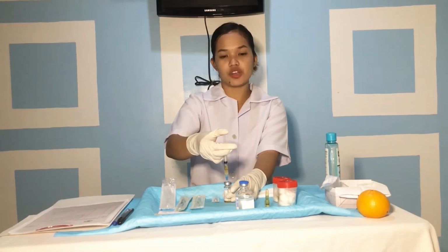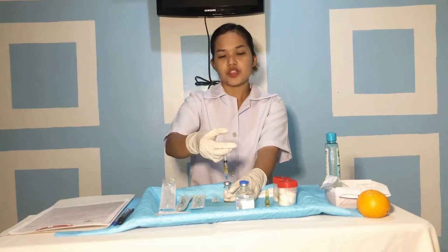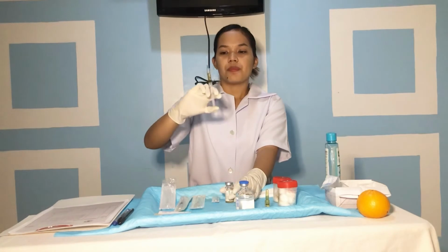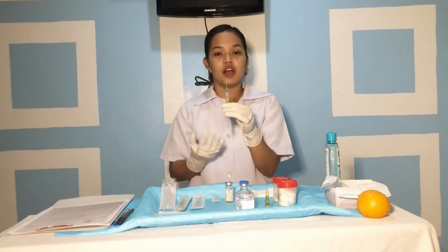Accumulation of air displaces medication and causes dosage errors. Next, we remove the needle from the vial by pulling up on the barrel of the syringe. Accidentally pulling the plunger rather than the barrel causes the plunger to separate from the barrel, resulting in loss of medication.